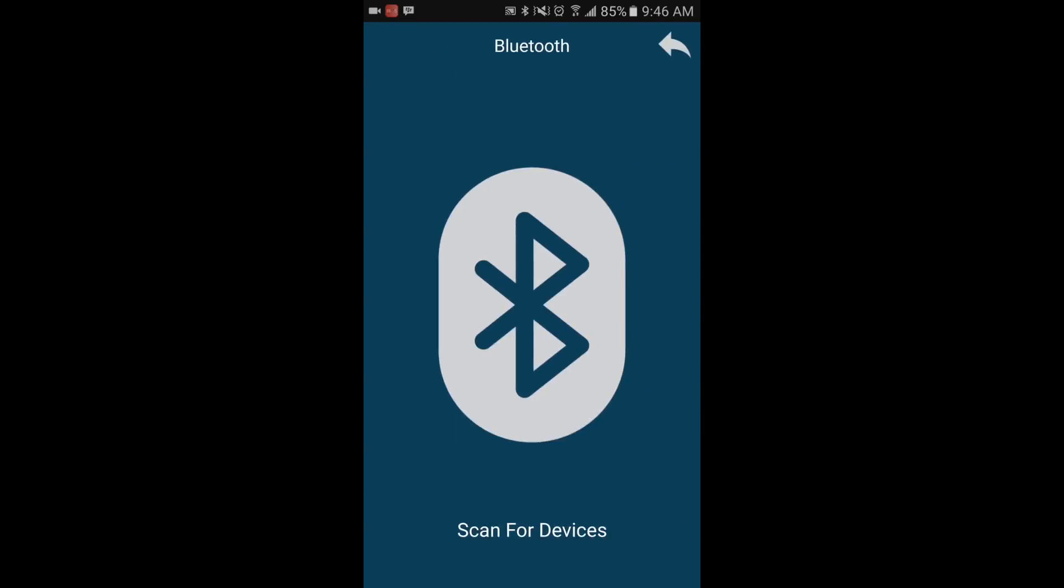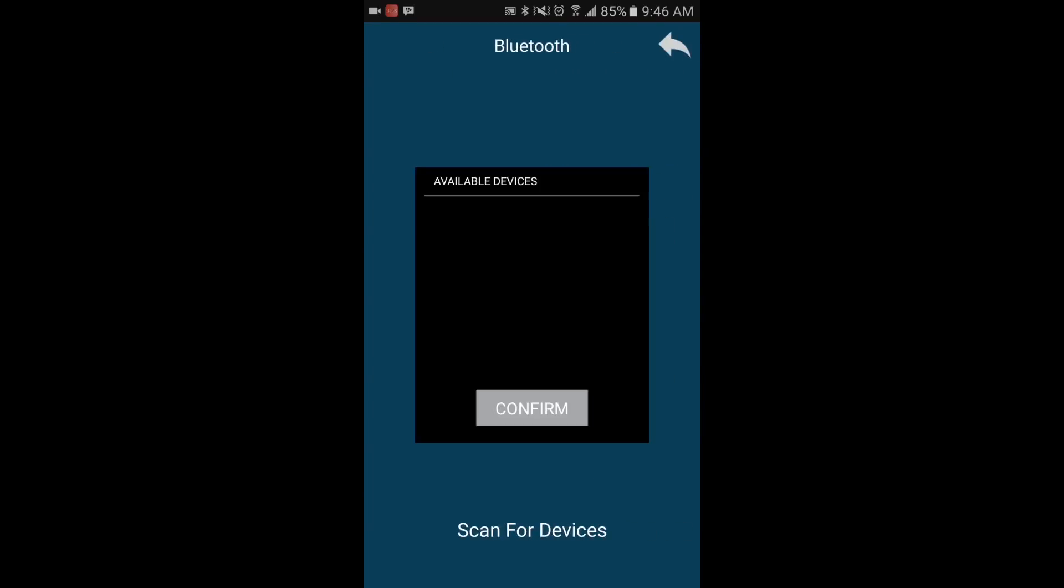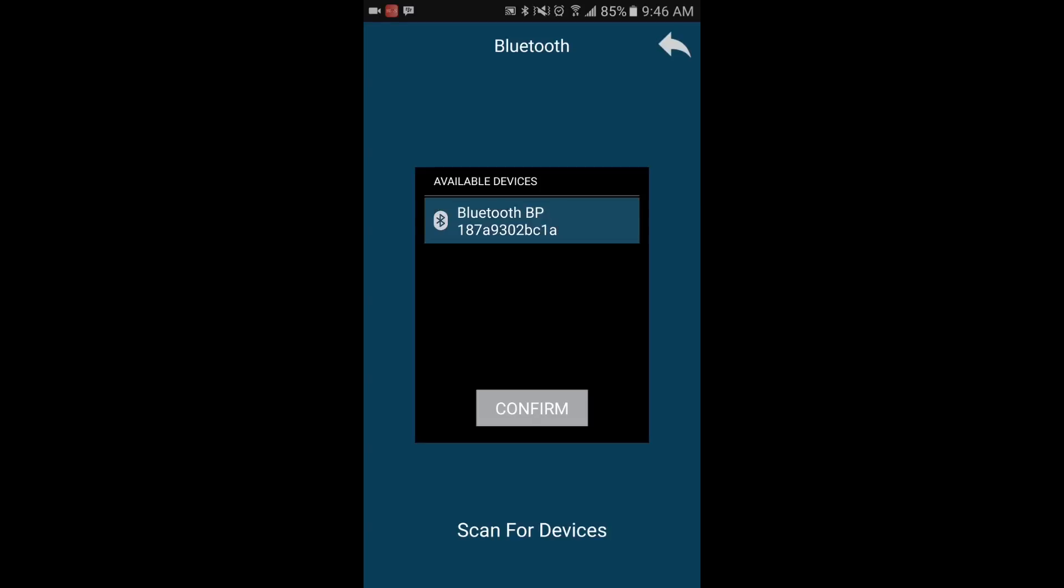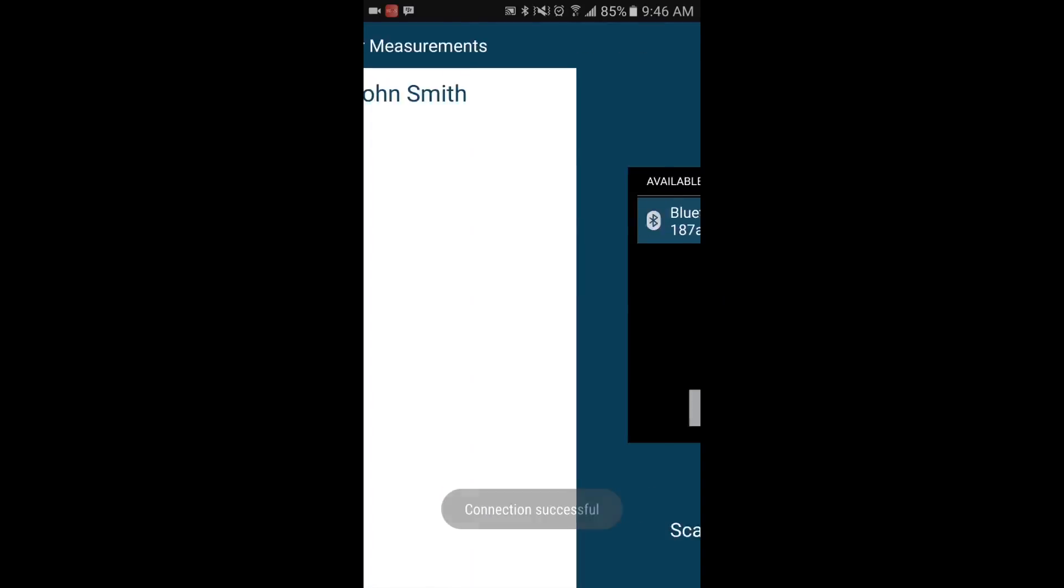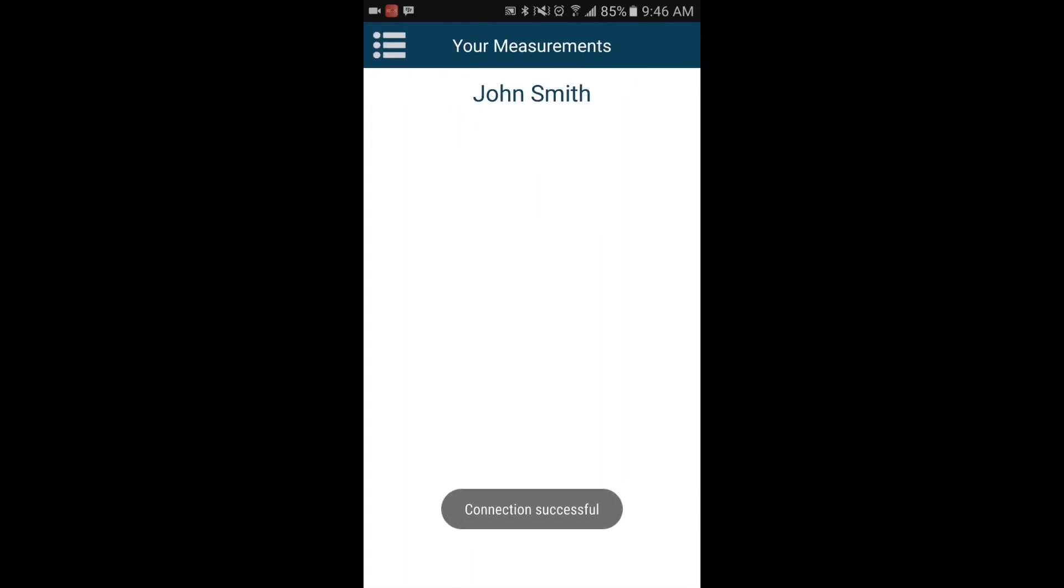The app will automatically search for any blood pressure monitor that is nearby. Select the monitor and press confirm.